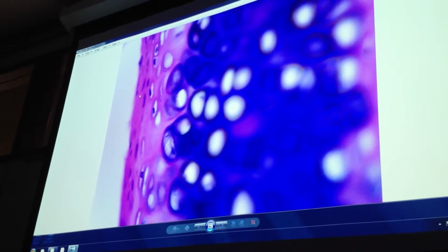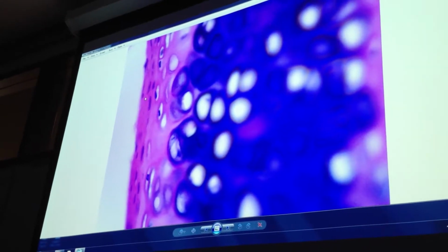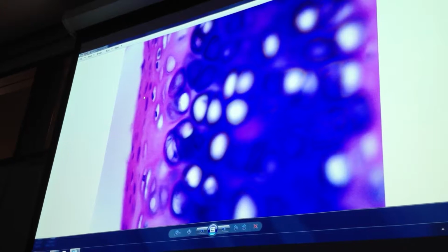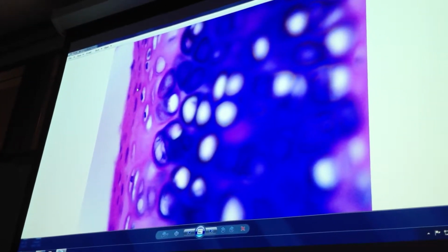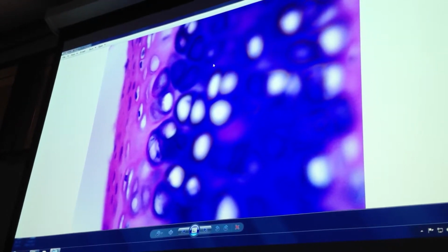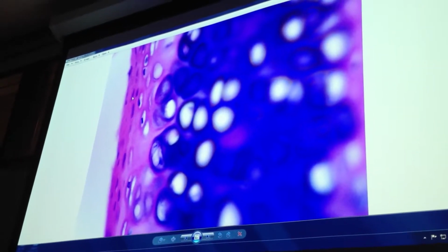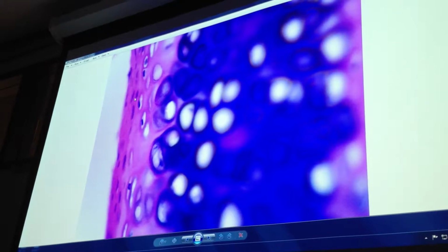Okay, now notice the perichondrium is fibrous tissue. Loose or dense? Dense. Regular or irregular? Regular. Okay. In some cases, not in the trachea, this will become bone. If this was the costal cartilages, at some time this becomes bone. What does the perichondrium become? If this turns to bone, this becomes the periosteum.